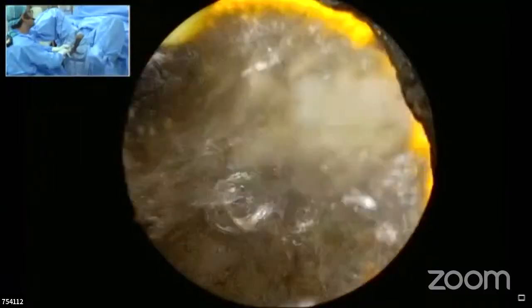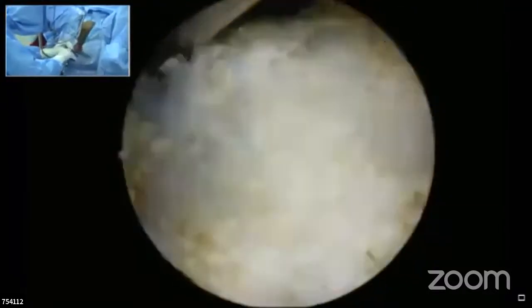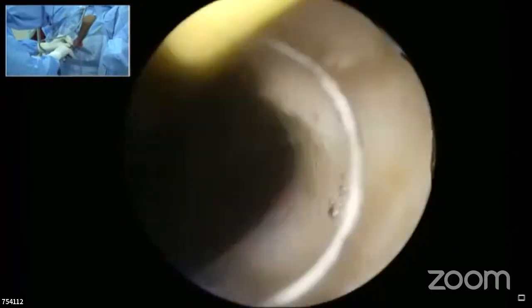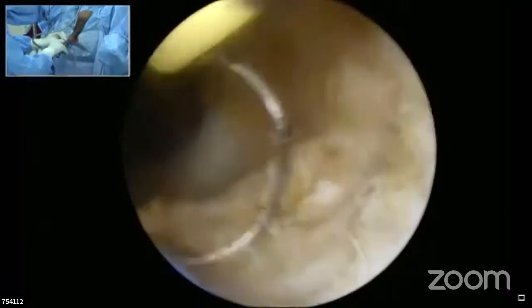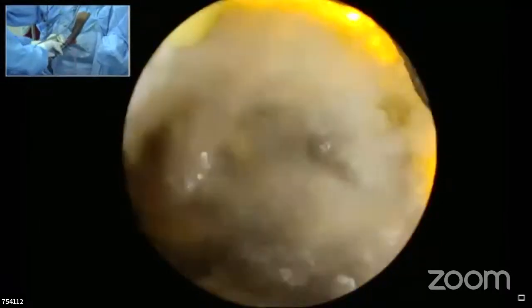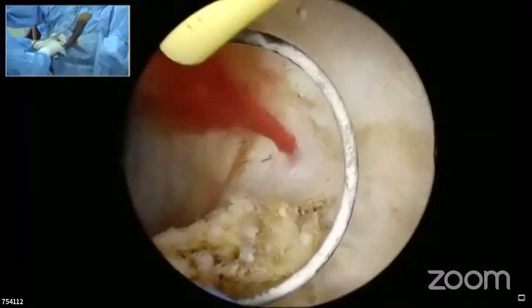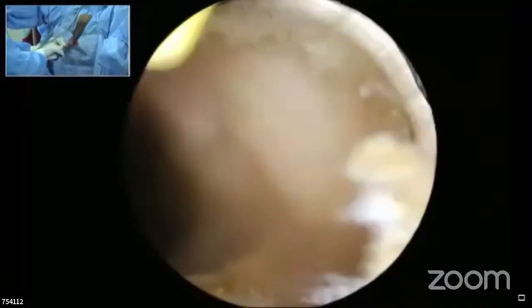Sometimes we may not see one single artery coming at that 11 and 1 o'clock positions. The thing may branch out and get 2-3 branches like this one. You may have another one coming up again. Sometimes it is only single, but majority of times it can be double also. It bifurcates much ahead, entering into the prostate, and we start bleeding.